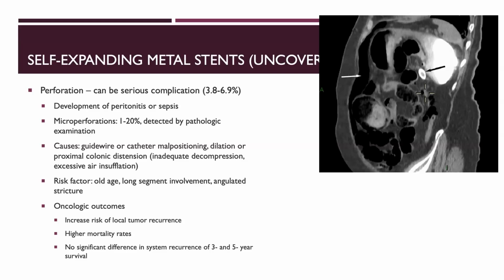The other thing to consider while I'm talking about this is if you have a high grade stricture with small bowel fecalization, make sure the patient's intubated for the procedure, because you are going to put water in there, you're going to put CO2 in there, and you never know what's going to happen as they start to get more proximally dilated. Their intra-abdominal pressure may go up and they may vomit. So if you have quite a bit of small bowel fecalization, really think about that and don't just settle that this is a colonoscopy that you can just do under conscious sedation or MAC.